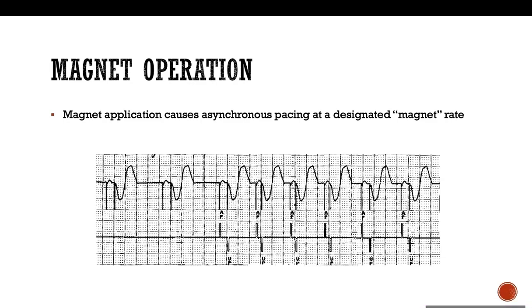Okay, so there are multiple things that we need to talk about. One, first of all, a patient has a pacemaker doesn't mean he's pacing all the time. So you ask them. Yes. A little bit intermittently, so we don't need to do anything for the device. Number two, if the patient is not paced on the monitor or on the ECG, that means he's not requiring a high amount of pacing. So you don't need to adjust the pacemaker since he's not using it most of the time.